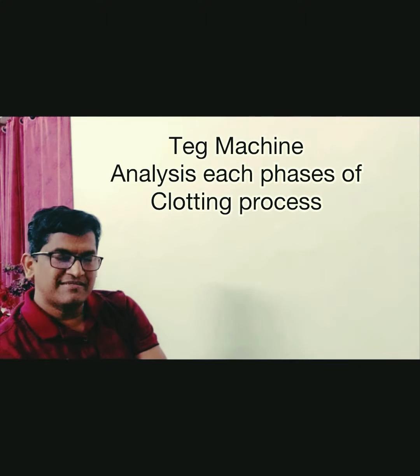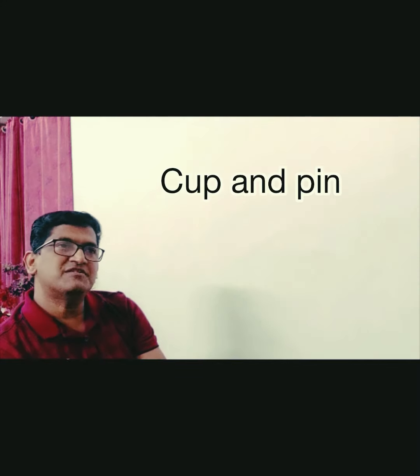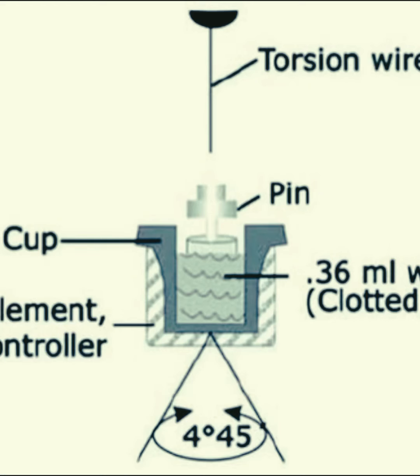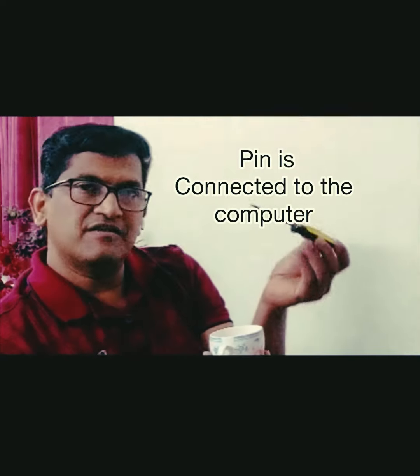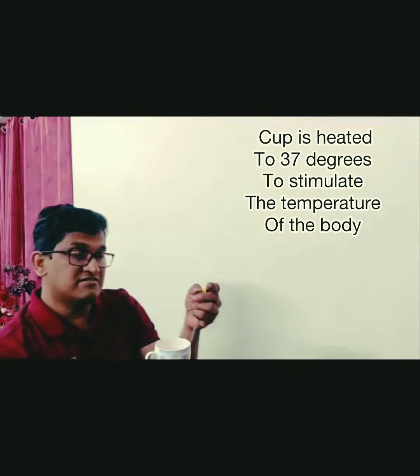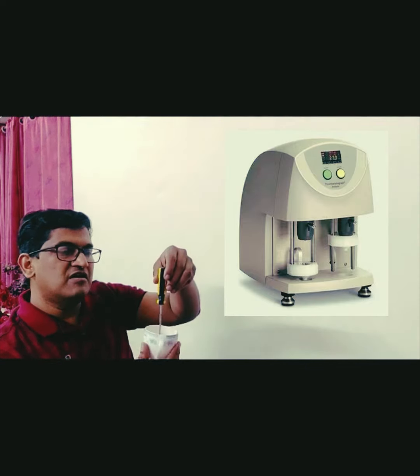As you know, thrombus formation is a 4-part process. The TEG machine analyzes each phase of the clotting process. The machine has a cup which oscillates, and there is a torsion pin submerged inside the cup. The pin is connected to the computer. Citrated blood is introduced in the cup, and the cup is heated to 37 degrees Celsius to simulate the temperature of the body. So the machine is switched on, the cup starts to oscillate, but the pin remains motionless until the clotting begins.